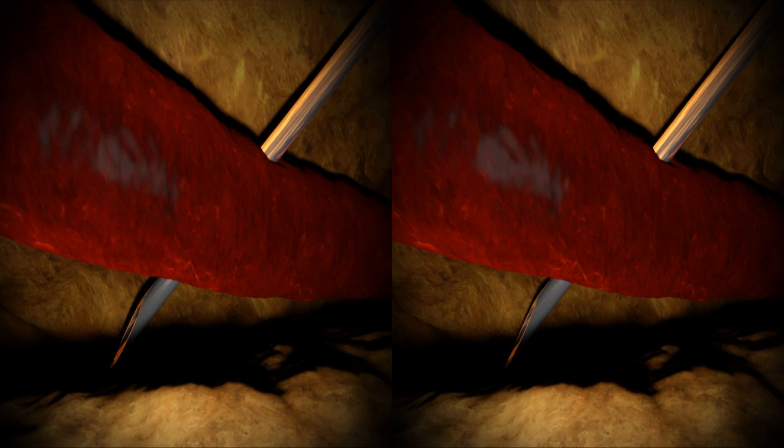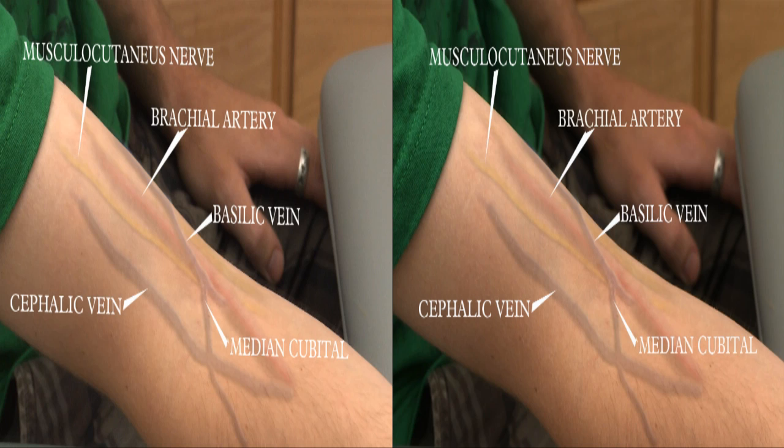But it can have other consequences as well. Serious complications are most likely to arise when targeting the basilic vein, with its close proximity to nerves, which can be permanently damaged, or the brachial artery, which could be nicked. Even with a proper angle, the appropriate needle size must be used.